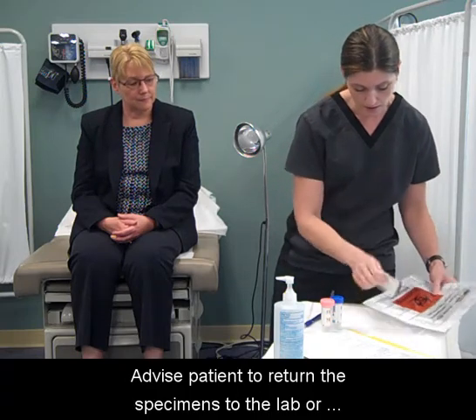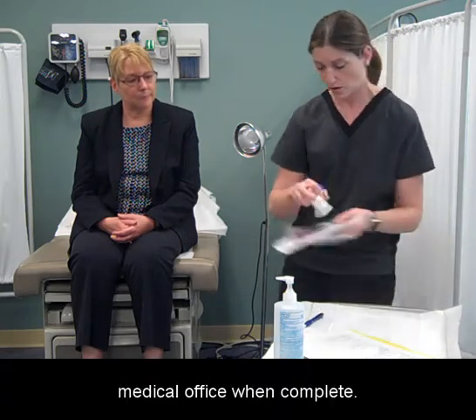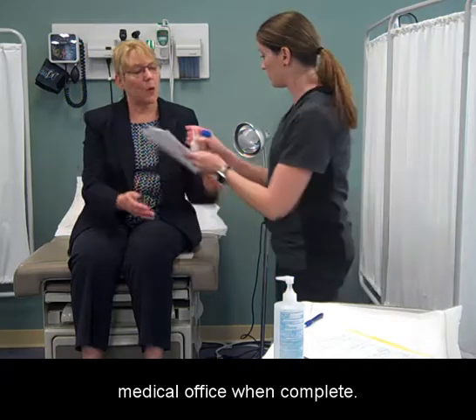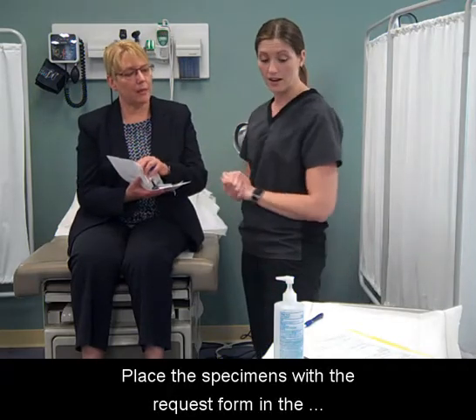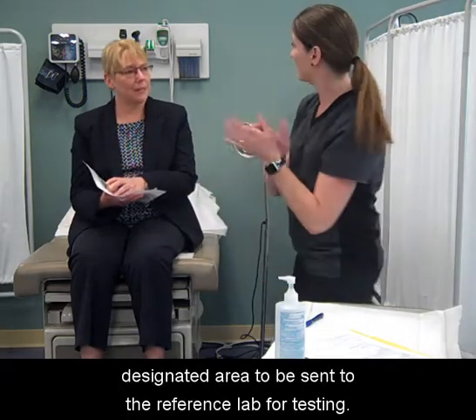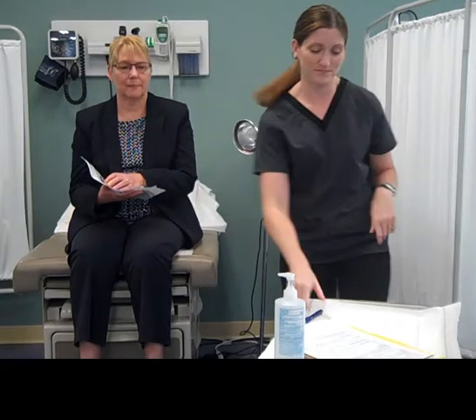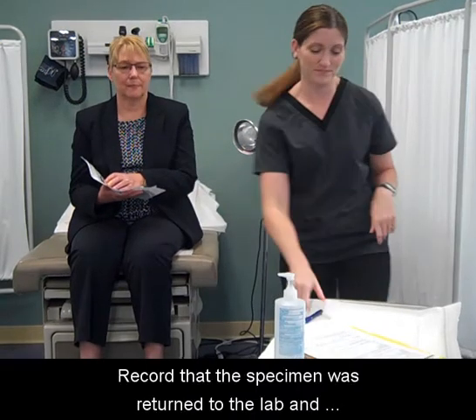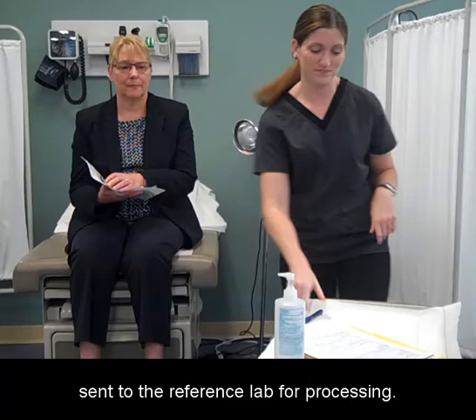Advise the patient to return the specimens to the lab or medical office when complete. Place the specimens with the request form in the designated area to be sent to the reference lab for testing. Record that the specimen was returned to the lab and sent to the reference lab for processing.